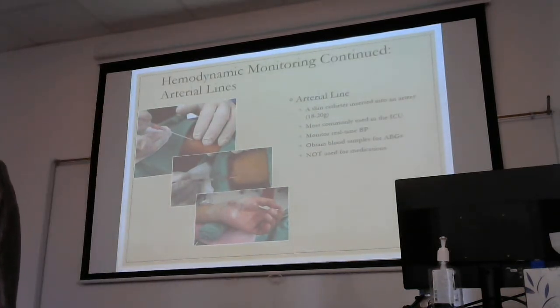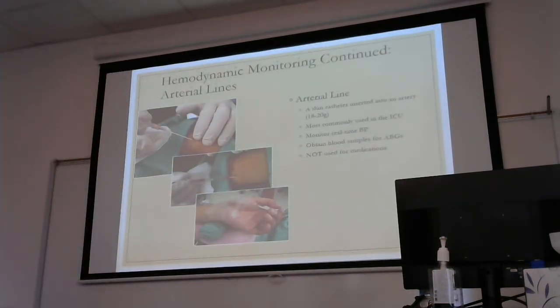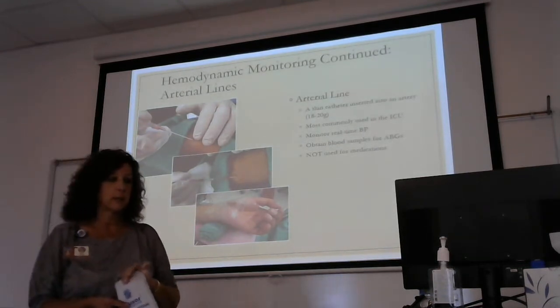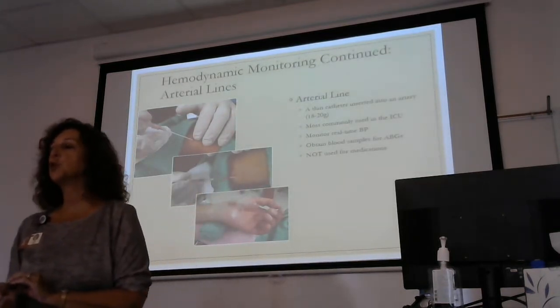Make sure that when you're saying things, you really understand what you're saying. So this is not going to be an infusion. This bag is not an infusion of anything. It's simply providing counter pressure in that arterial space. That's all it's doing. It's not infusing, so don't refer to it as an infusion, because it's not. So in this arterial space, I know that I can draw from, but I can't put to.